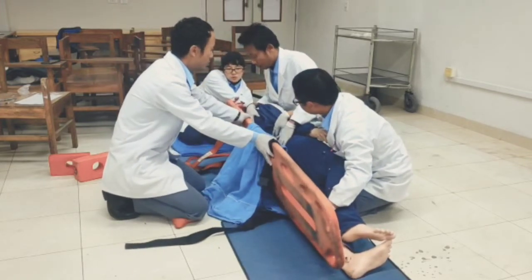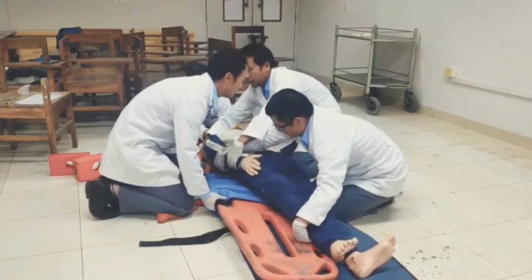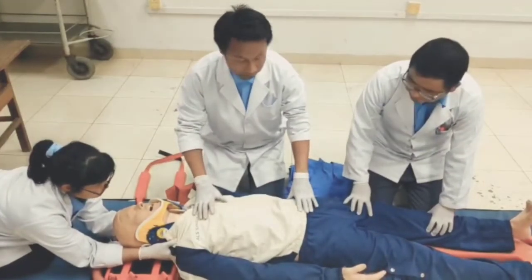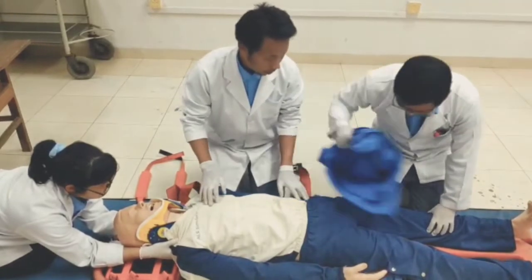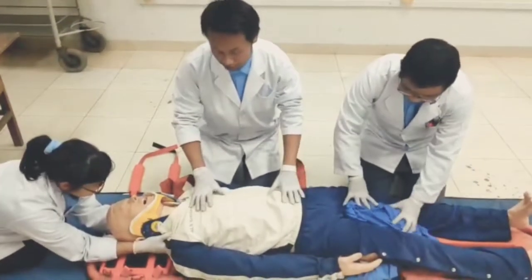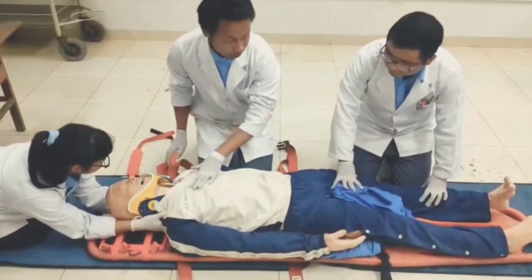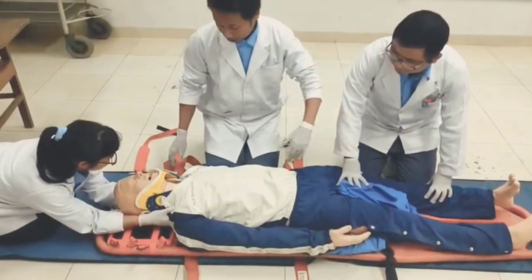One, two, three. On the spinal board, we have to do padding. Then we will secure the patient from chest to lower extremities.